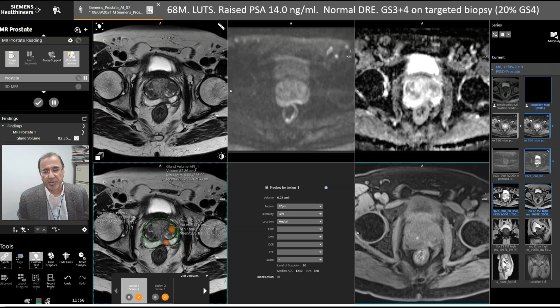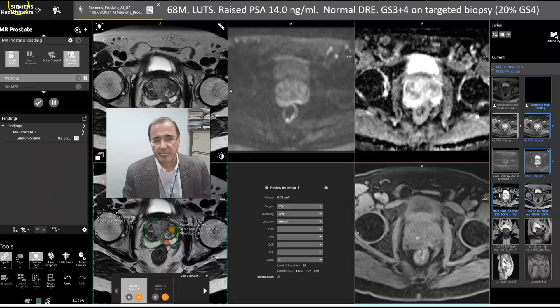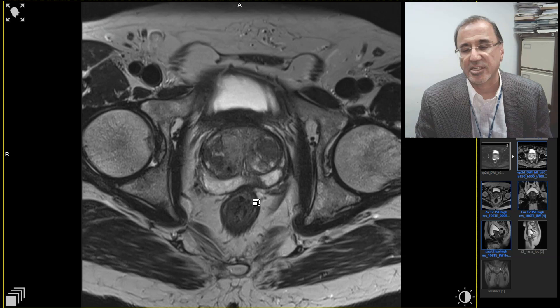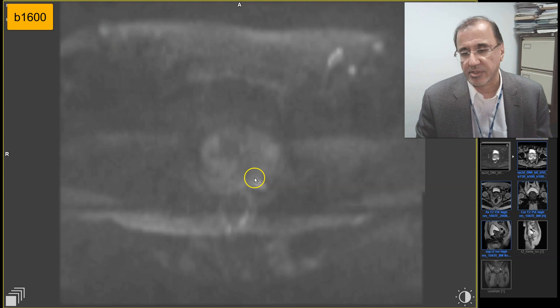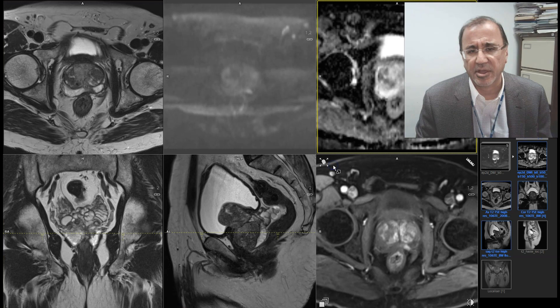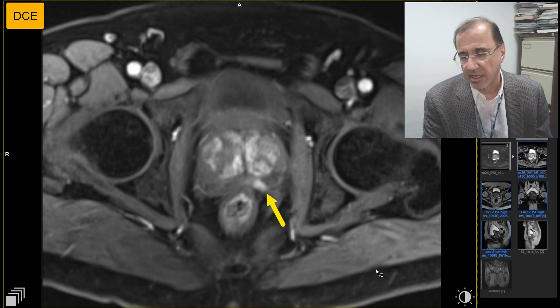This is a 68-year-old man with a raised PSA. He has a lesion in the left peripheral zone medially, shown on targeted biopsy to be a 3+4 cancer. On the axial image, we can see the lesion in the medial aspect of the left peripheral zone with a scar and a little retraction of the prostatic capsule. On the ultra-high B-value, there is a focal area of hyperintensity with a low ADC — a PIRADS-4 lesion confirmed by early intense focal enhancement on dynamic contrast enhancement.